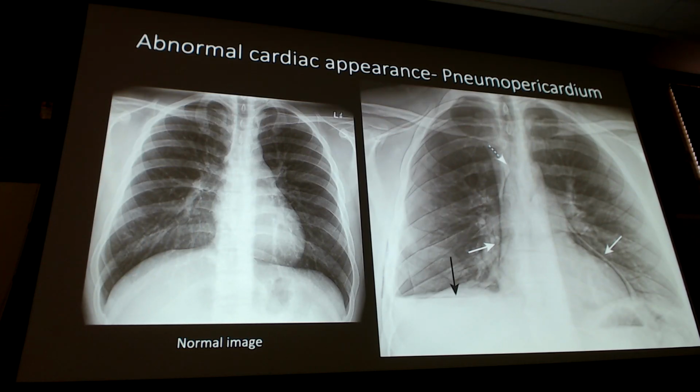But on my pneumopericardium, I have air in the pericardium. Now I have this radiopaque line, and it's sandwiched in with a radiolucent line right here. Now I can say, where's my pericardium? You guys like, right there? Because the air is separating it from the heart, because there's air in the pericardium. Same thing on this side here. I have this radiolucent line coming down that's not typically here on this side, on the normal. Okay? So that is how you can tell there's a pneumopericardium on X-ray.